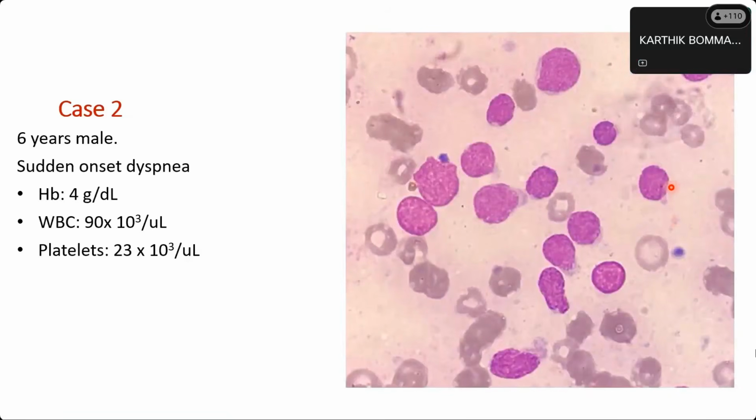So this is the morphology in the peripheral blood. How are these cells as compared to the previous case morphology? What is the difference in the morphology you see in this case, Dr. Ruchika? So here we are having a high NC ratio. And size of the cells? They are 1.5 to 2 times the size of the RBC. Okay, you used RBC as a size comparator? Lymphocyte, yes, sorry sir, small mature lymphocyte.